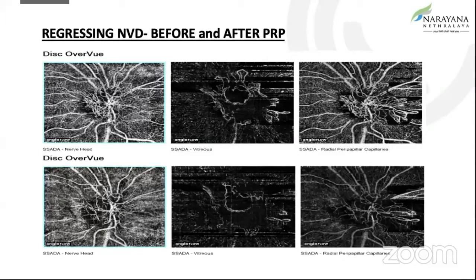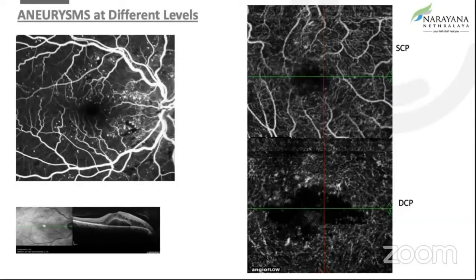The automated segmentation is also available. This is the regressing NVD before and after PRP — in the panel above, the NVD is extensive, but post-PRP, you see it regressing. We are also able to see aneurysms at different levels, and especially with macular edema, we are able to see them at the DCP level as well.